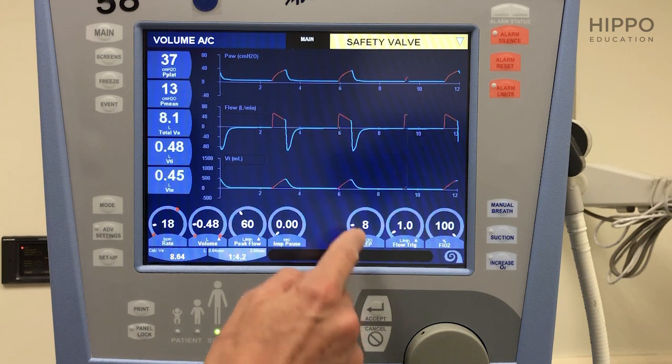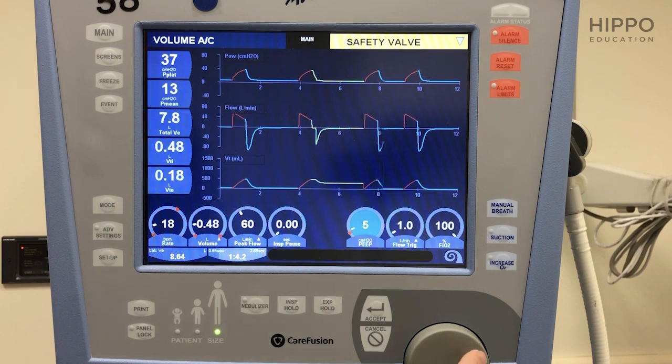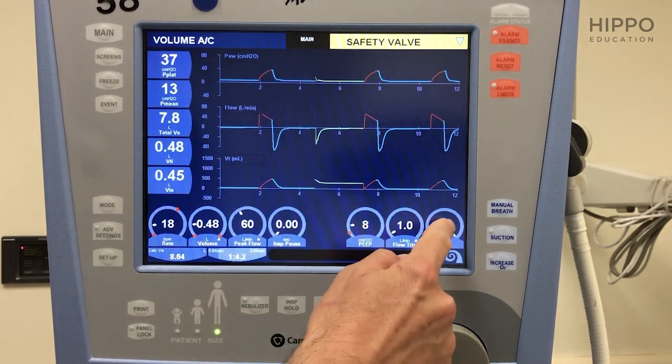Let's move on to PEEP. So this PEEP here is set at 8. Remembering at the lowest, really for the ARDSNet protocol, is 5, and you're going to be bumping that up based on your oxygen requirements. For COVID, we're going to set that starting at about 8. Accept. And then the final one, FiO2.